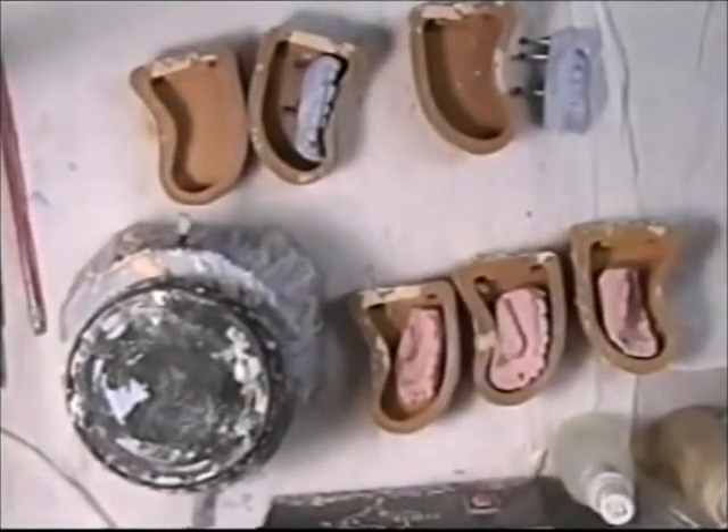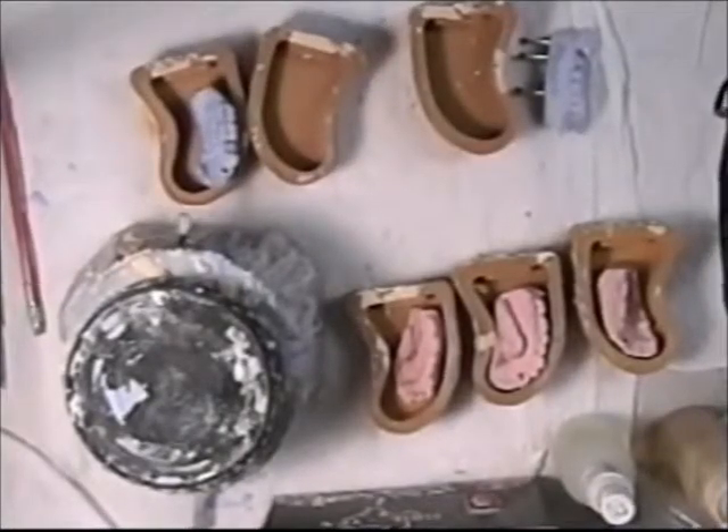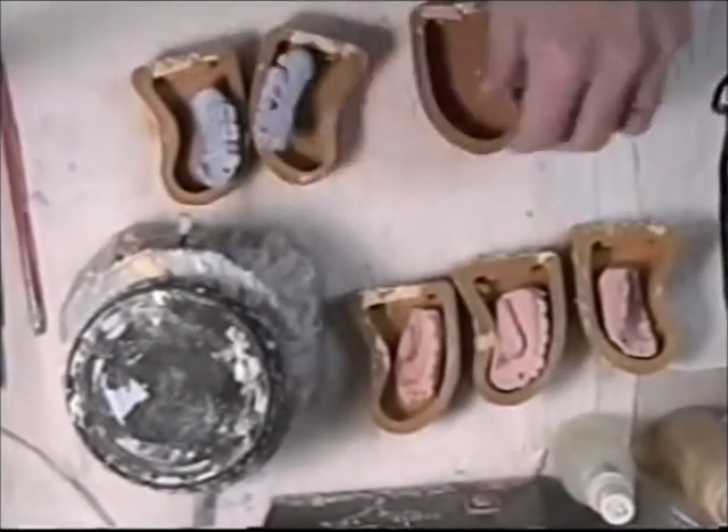I don't want too much, so I will blow off any remaining. I just want a light film there. That will allow us to separate the two stones here.